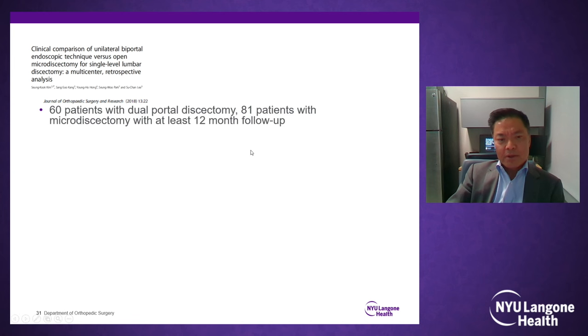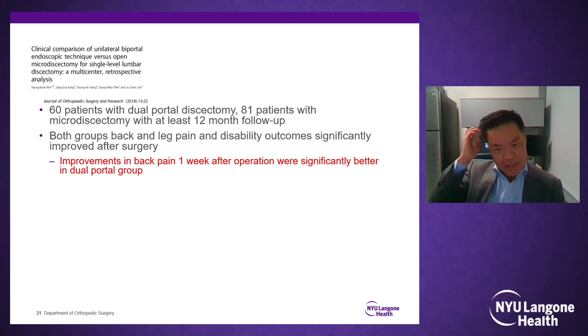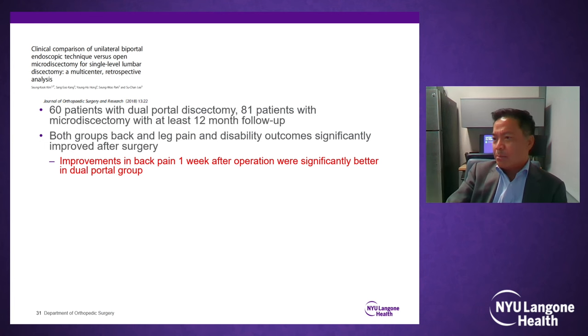This is one quick study I'm going to show that compares the endoscopic dual portal surgery to the open technique and follows the patients for 12 months. They all had similar outcomes, except that patients had significantly less pain immediately for the first week post-op. So what is the take-home? You may say, then what's the purpose? What's the use of endoscopic surgery? But at the end of the day, everyone did the same, and everyone did very well. Well, do you want to have a baby with or without epidural? That's my statement, right? That first week of pain can be quite severe.